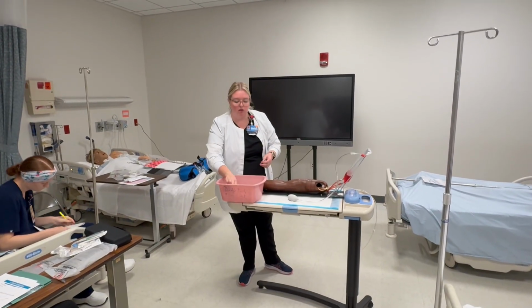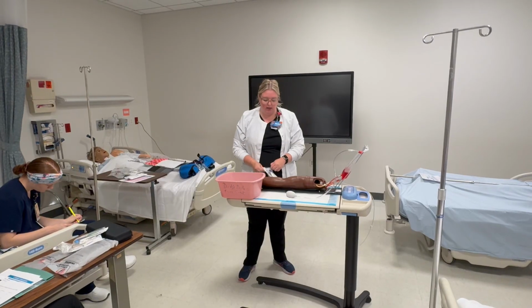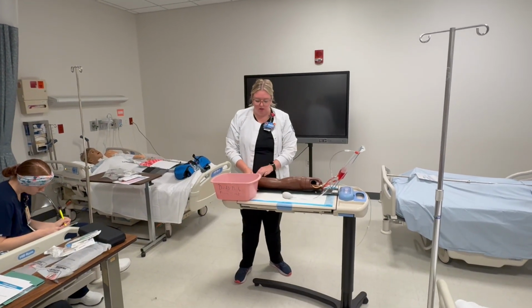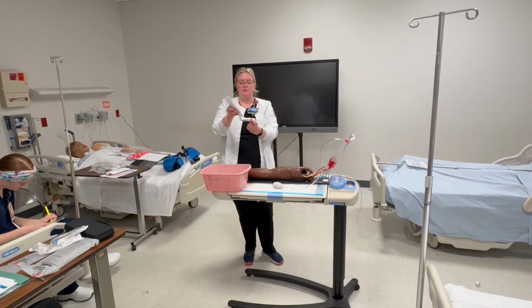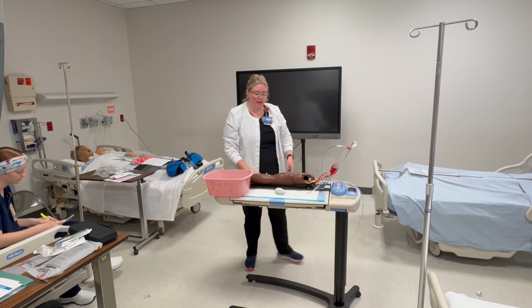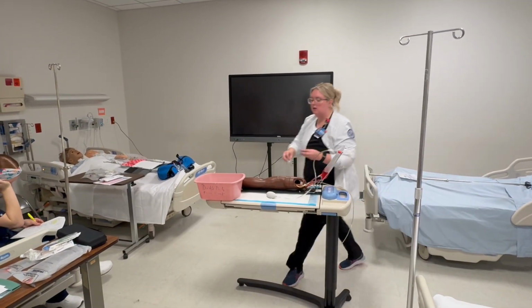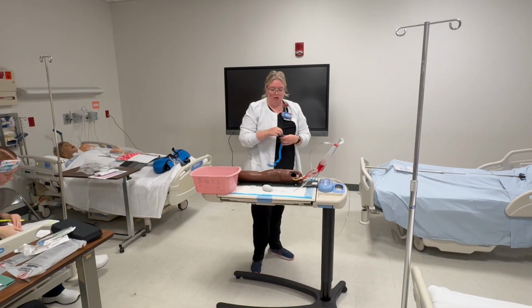I'm going to open my kit here. When you open your kits, don't pull this paper all the way off. Leave it so that you can recover and reuse it. Your tourniquet is in there. All right.